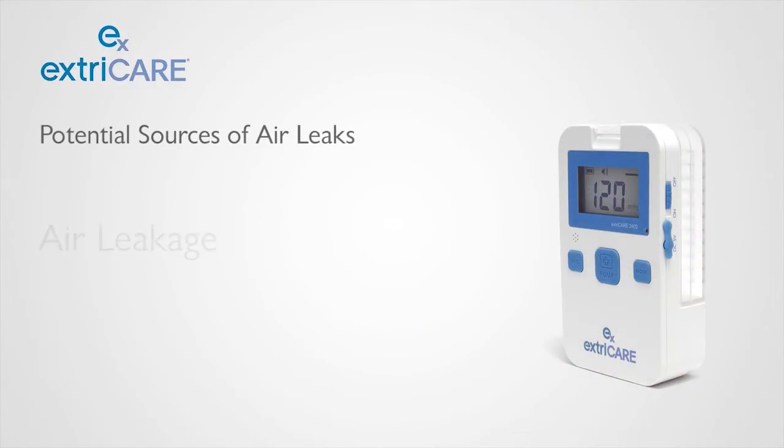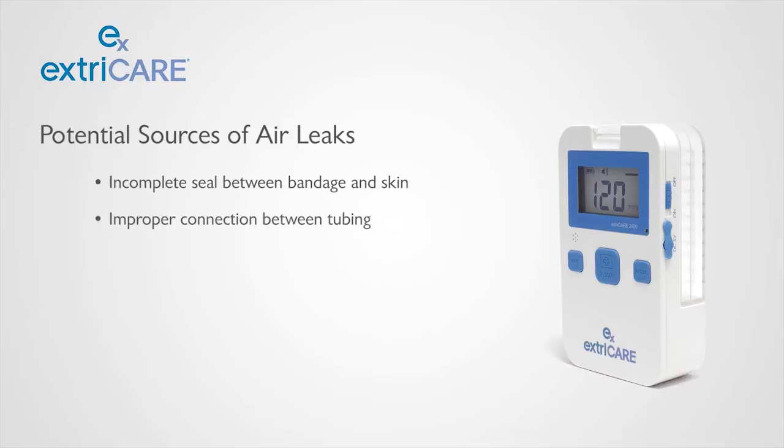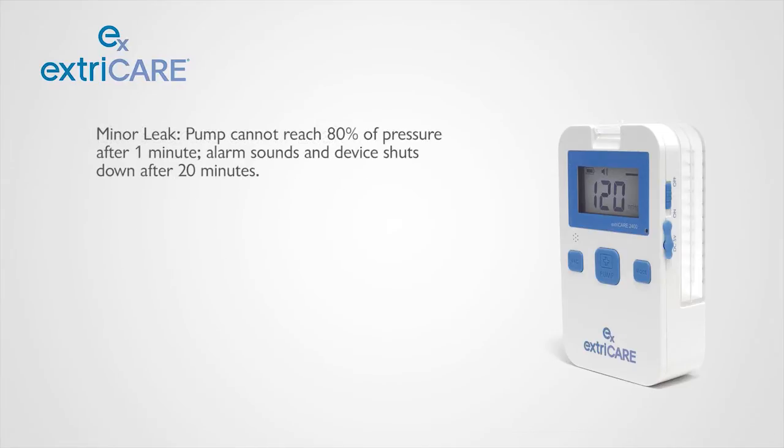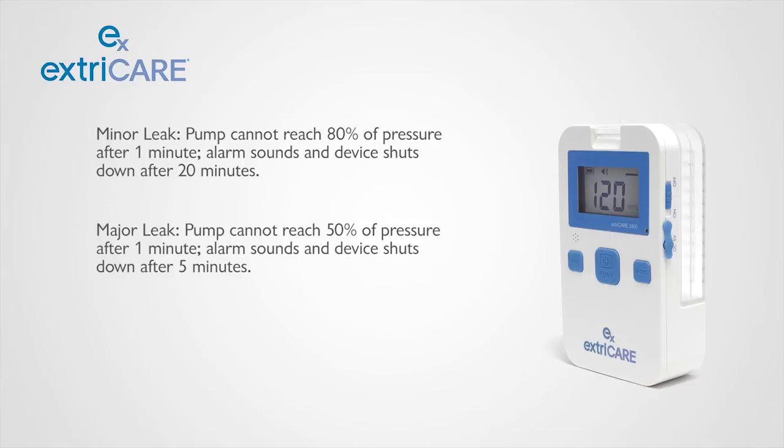There are various potential sources of air leaks, including an incomplete seal between bandage and skin, improper connection between tubing, and/or canister leakage. For minor leaks, an alarm will sound and the system will shut down after 20 minutes. For major leaks, an alarm will sound and the system will shut down after 5 minutes.